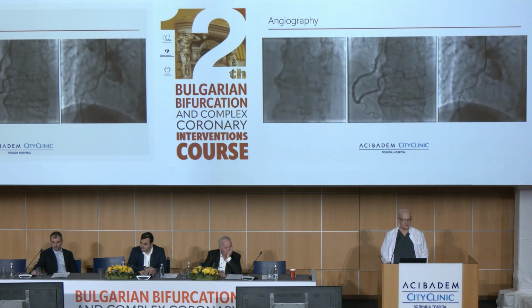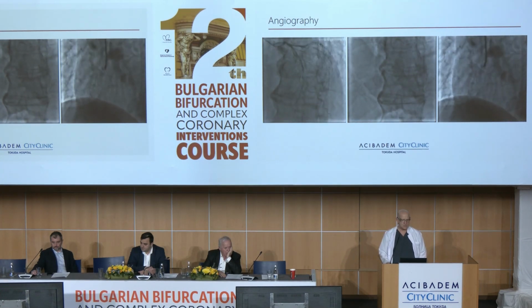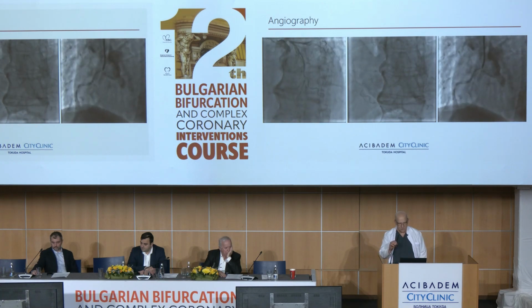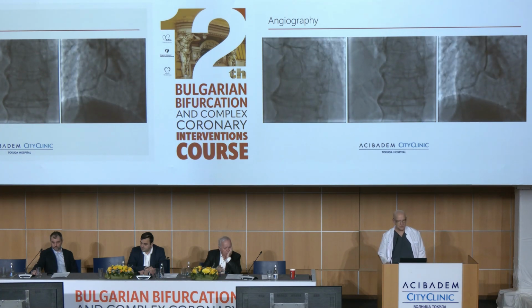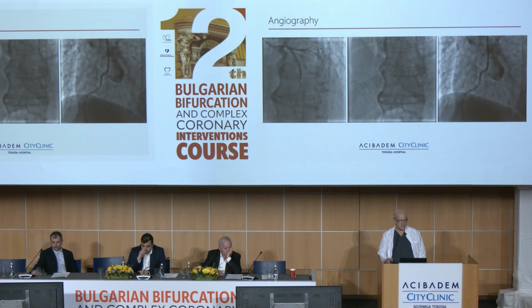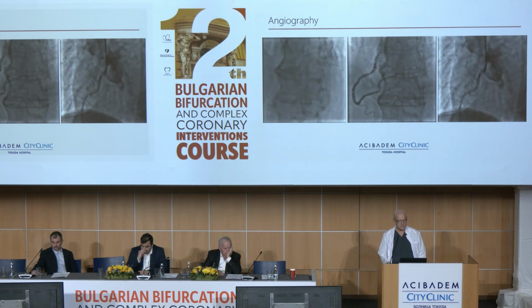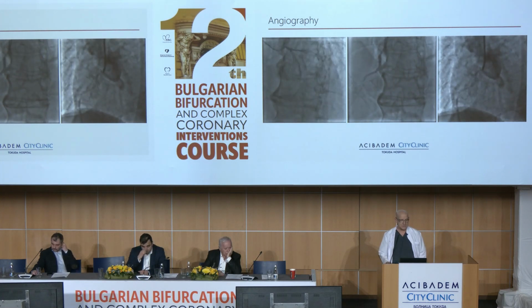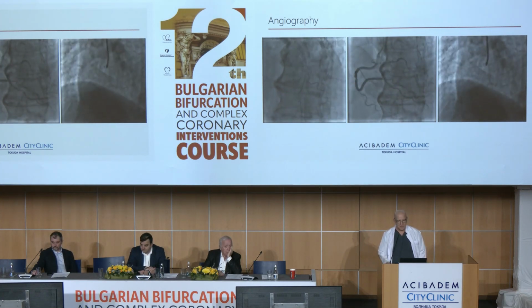artery is diseased. There was something at the ostium, but for sure it is not well seen here, but in one of the projections you can see, when you stop the movie just when the diagnostic catheter was out, there is probably at least 50% stenosis.